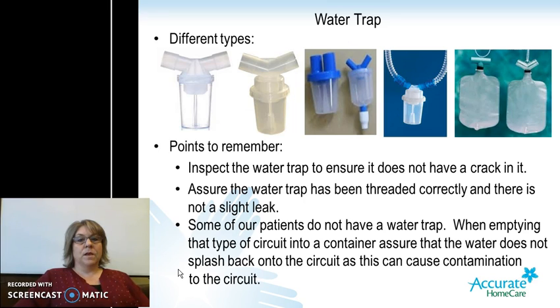The water traps themselves. There are different kinds out there. Some of them have a cup on them that you will twist off and dump out and then twist back on. Some of them have a port on the end that you open, allow it to drain, and then shut up again. There's also some of the older traditional water bags that you will open up the port at the bottom, drain out, and then close it again.